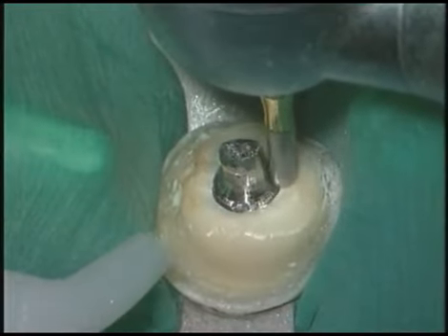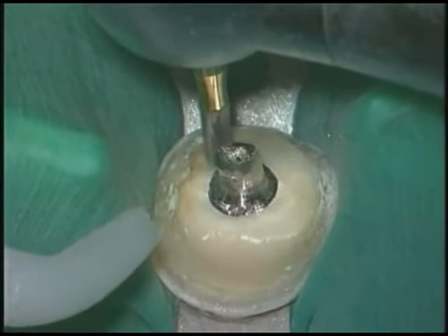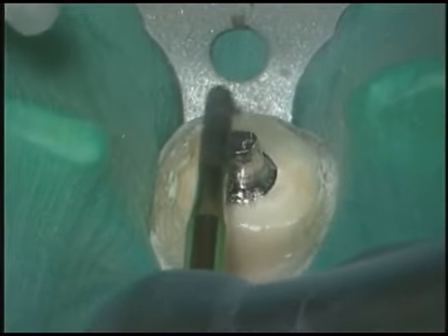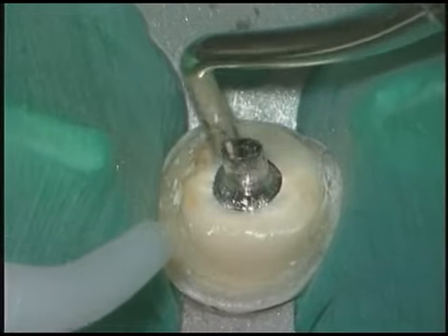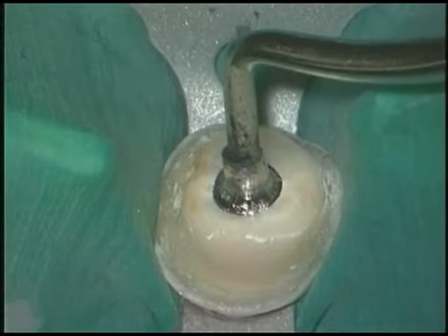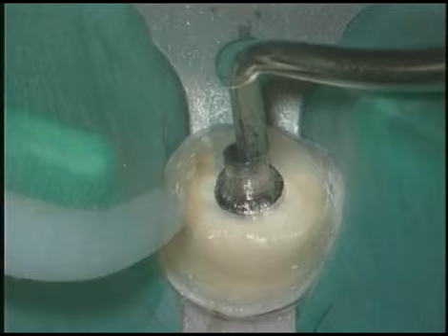Slowly and progressively mill the post down. Smooth off the top of the post and again select ultrasonics, keeping in mind the 10-minute rule. In this instance, I'm using an earlier version of the Pro Ultra 1 to vibrate the post. If after 10 minutes ultrasonics is unsuccessful, proceed to the PRS.